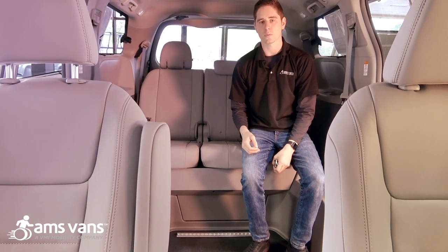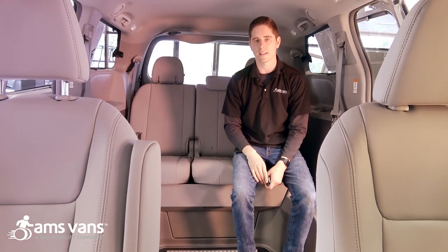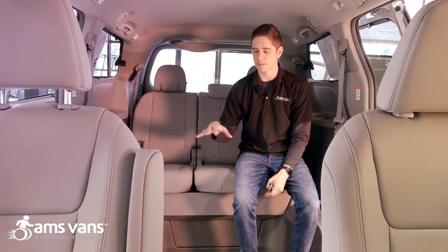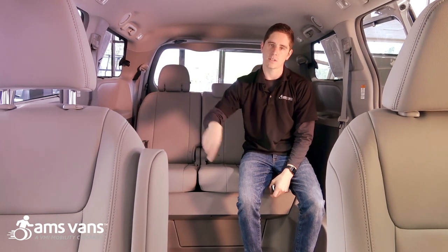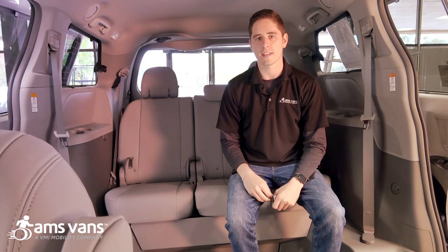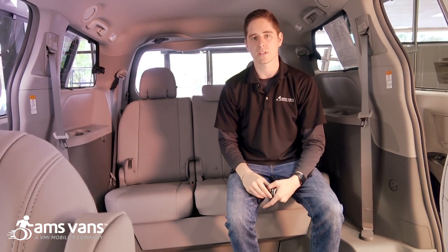The majority of manual chairs can as well — it just depends on the leg rest. That's what we'll do a good job of covering in the needs assessment, to make sure that the wheelchair you have will actually be able to fit in this conversion. It's one of the more spacious, very roomy conversions that accommodates the majority of wheelchairs on the market.